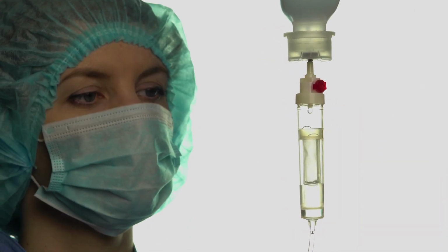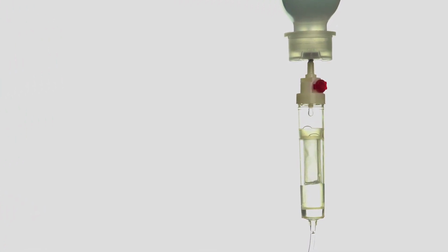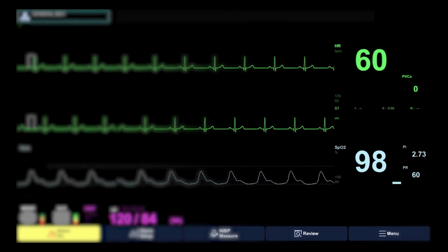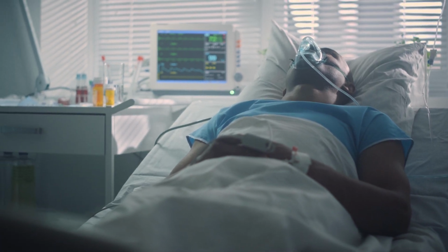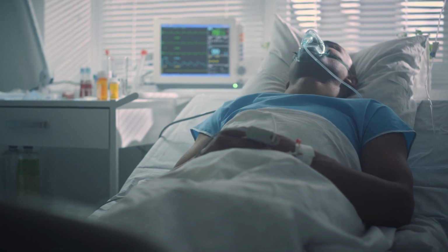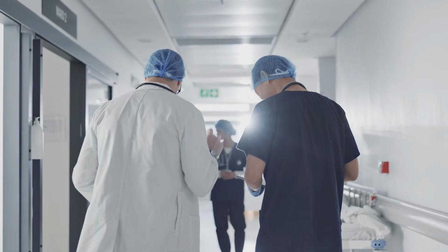After inserting the central venous catheter, initiate infusion by connecting it to fluids or blood as needed. As the patient's vital signs stabilize with the infusion of appropriate fluids, we move forward in their care journey. In the urgency of the situation, the combination of eFAST ultrasound scans and timely central venous access emerges as the key to effective emergency medical care, offering hope and a lifeline to those in critical need.